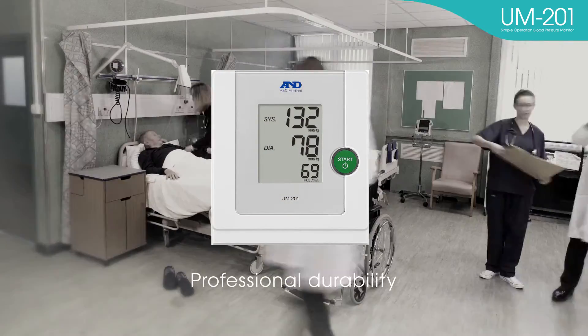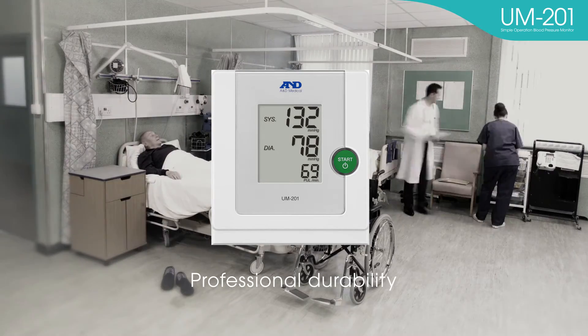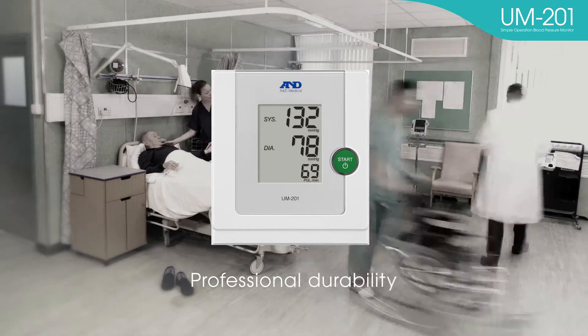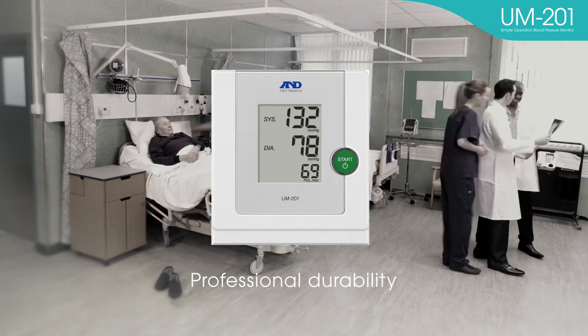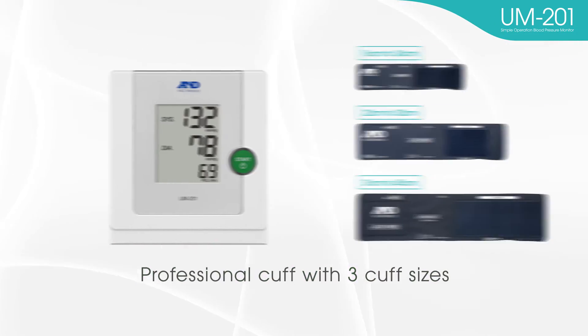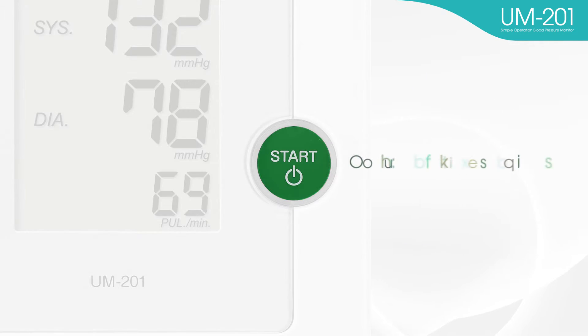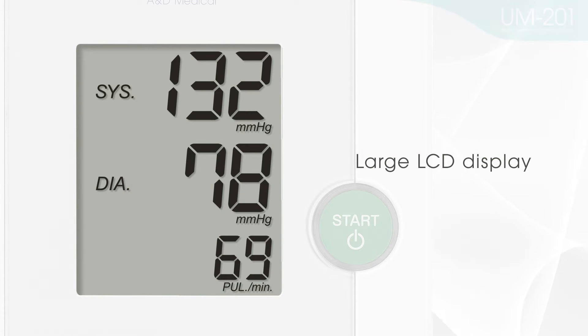Professional durability. The components and parts in the UM-201 are designed for professional use and ensure long-lasting durability. Additional features include a professional cuff with three cuff sizes, one-touch operation, and a large LCD display.